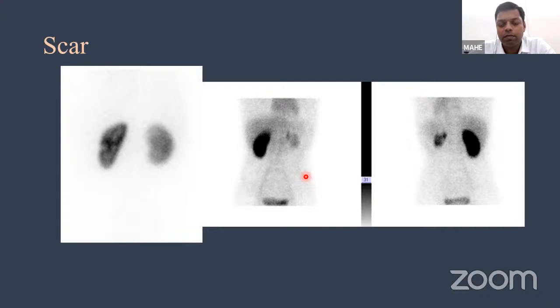If the patient is suffering from an acute pyelonephritic episode, ultrasound is not picking up any foci, you send for a DMSA scan. If you see a photopenic area, then that is the foci of pyelonephritis. Focal or bilateral, everything you can see. Whereas for scarring, you need to do it 6 months post the acute pyelonephritis episode. If you see any photopenic area during afebrile period, 6 months post the acute pyelonephritis, then it is a scar.